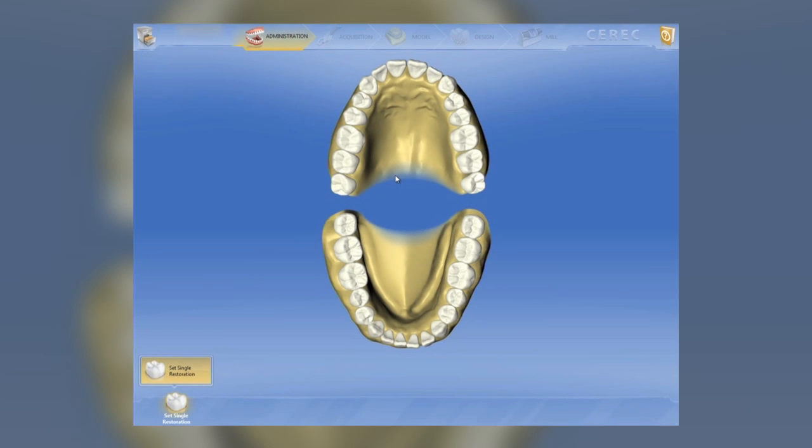This is Dr. Armin Rezaian from CerecDoctors.com. We're going to feature a crown restoration done with Cerec version 4.0.